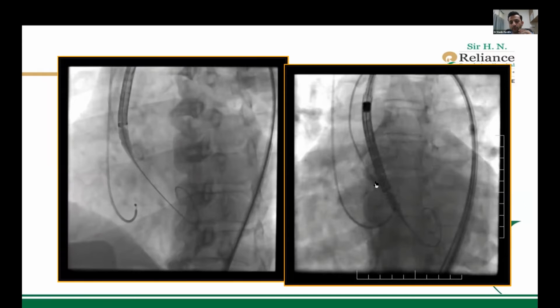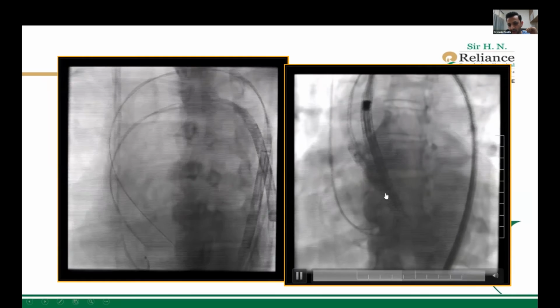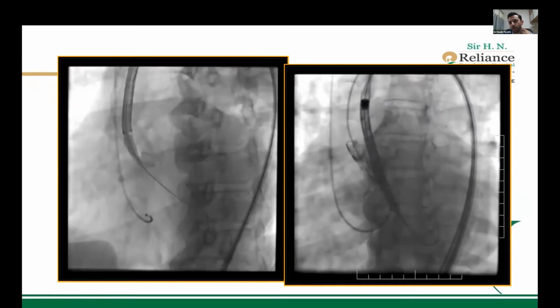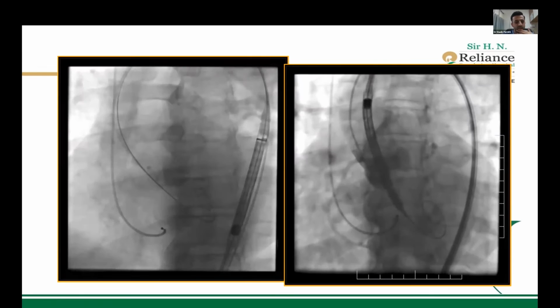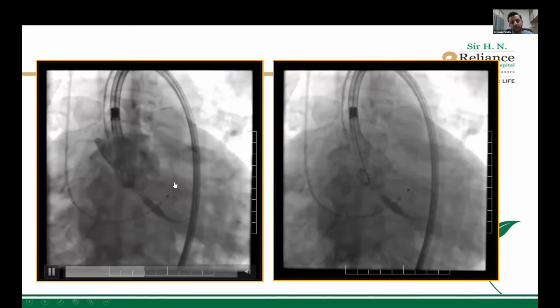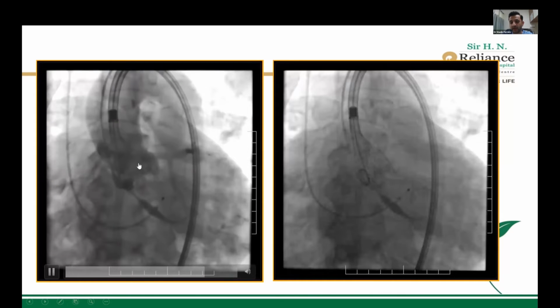This is how you position the valve. The lower dark band, which is the capsule head marker, you have to position it. The final depth of the deployment of an Evolut valve is between 2 to 5 millimeter below the annulus. So that's the recommended IFU depth. This is at 80 or 90% deployment. The valve is partially open, but still completely retrievable and recapturable.